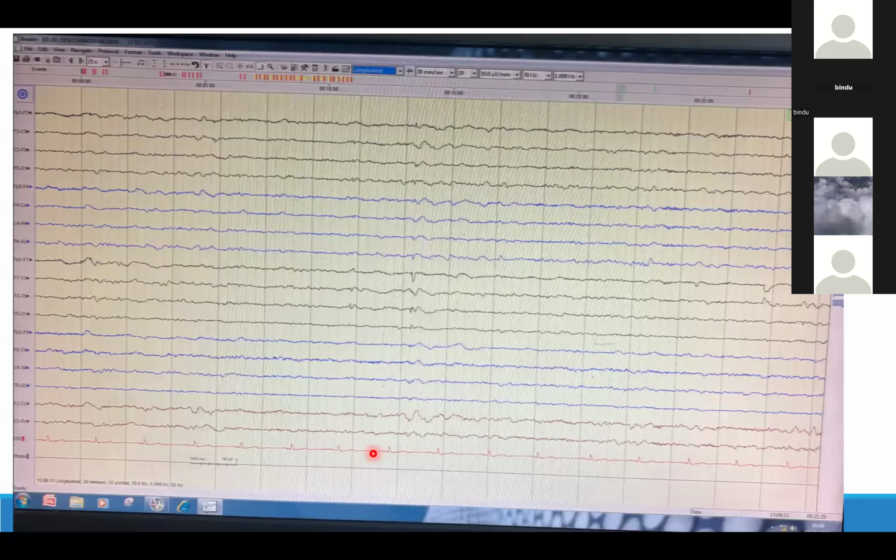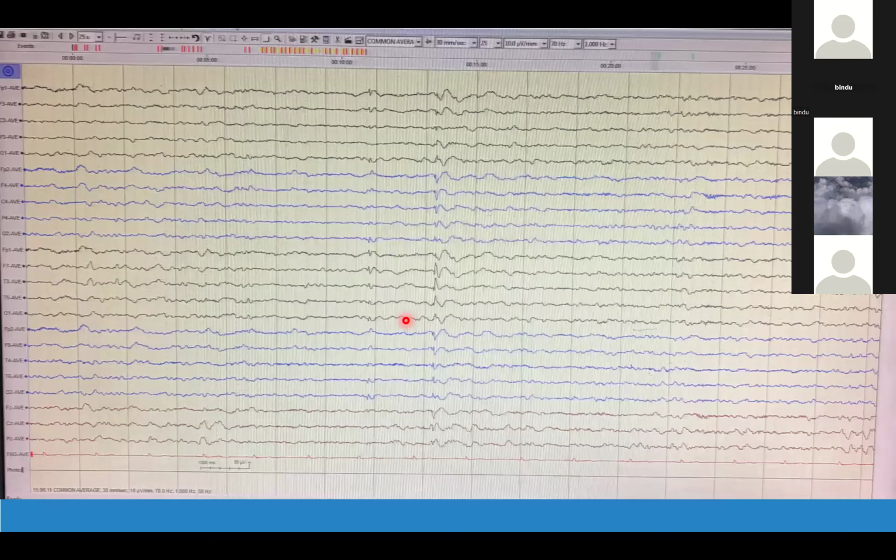This was a patient with Alzheimer's disease. This EEG was read in bipolar montage. The patient was drowsy, and it showed anterior left temporal spikes. The same read in average montage shows left temporal slowing also, but the patient was drowsy, probably asleep, with poor background activity.